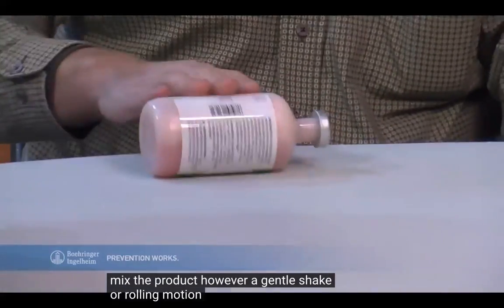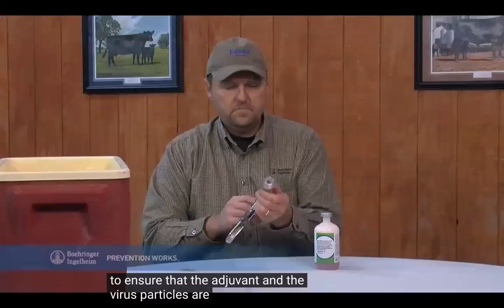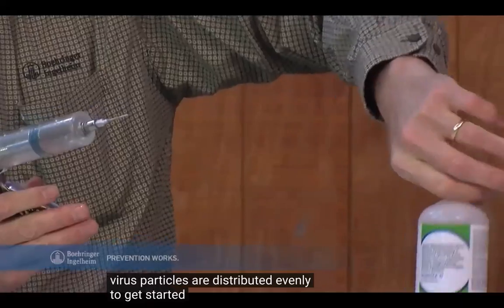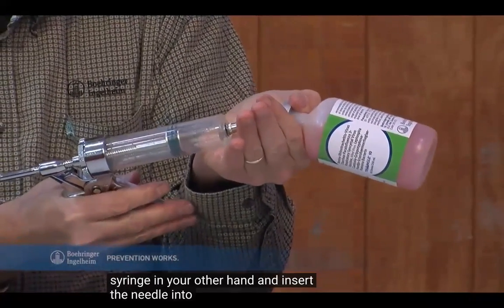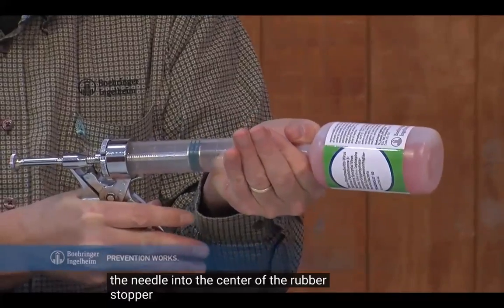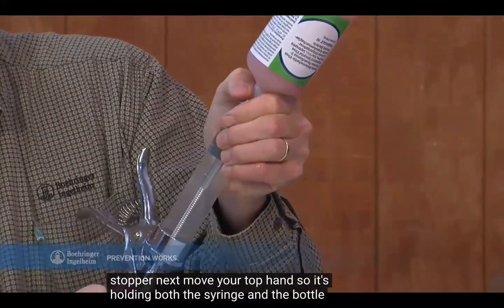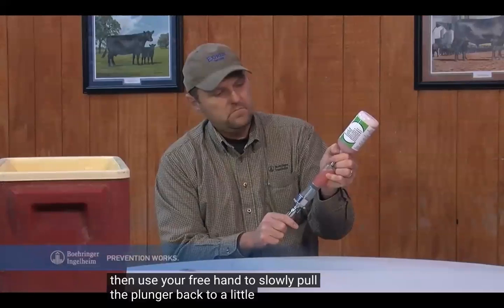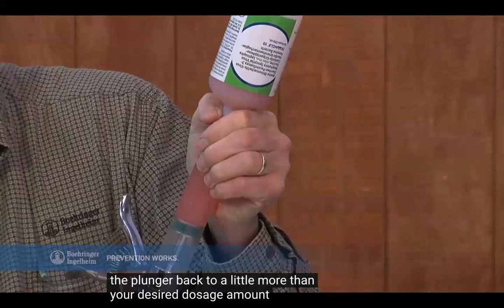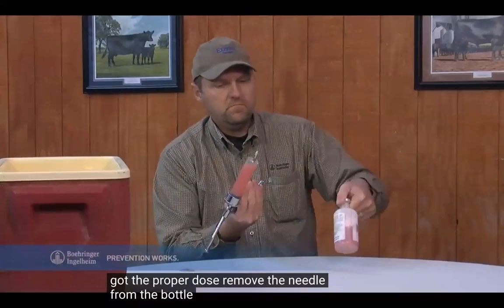A gentle shake or rolling motion before use is required to ensure that the adjuvant and the virus particles are distributed evenly. To get started, use one hand to tip the bottle toward you at an angle. Hold the syringe in your other hand and insert the needle into the center of the rubber stopper. Next, move your top hand so it's holding both the syringe and the bottle. Then, use your free hand to slowly pull the plunger back to a little more than your desired dosage amount. Once you've got the proper dose, remove the needle from the bottle.